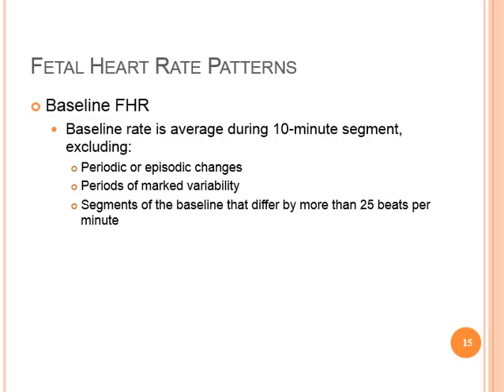Baseline fetal heart rate. The baseline fetal heart rate is the average rate during a 10-minute segment that excludes periodic or episodic changes, periods of marked variability, and segments of the baseline that differ by more than 25 beats per minute. There must be at least 2 minutes of interpretable baseline data in a 10-minute segment of tracing to determine the baseline fetal heart rate.